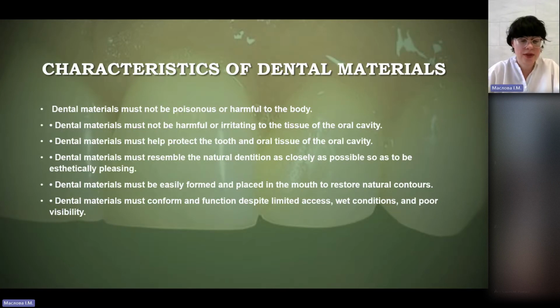Decay removal and tooth preparation tool that is often used in place of the traditional dental drill, this innovative system, air or hydroabrasion, allows to conserve more natural tooth structure and to reduce the risk of enamel microfracturing. Because the equipment doesn't produce vibration or heat, patients require little or no anesthetic. It's a very important part of the dental treatment. They all work essentially by blowing aluminum oxide or silicon powder using compressed air through tips.